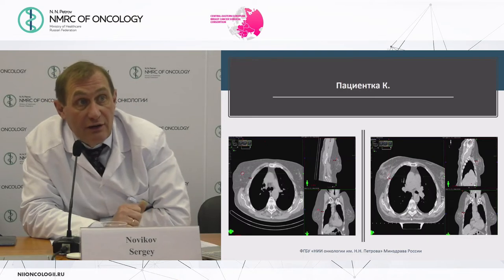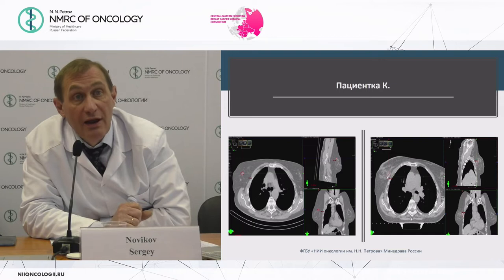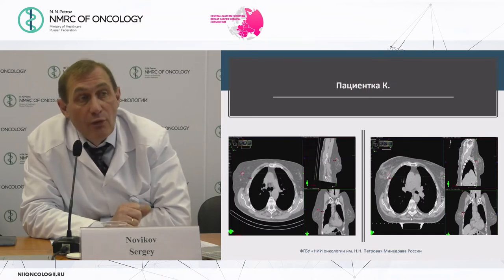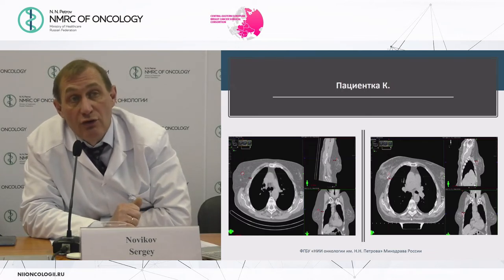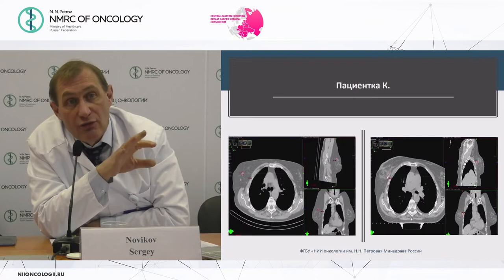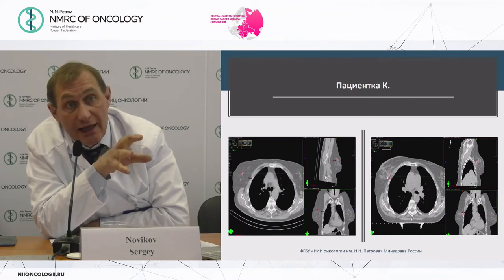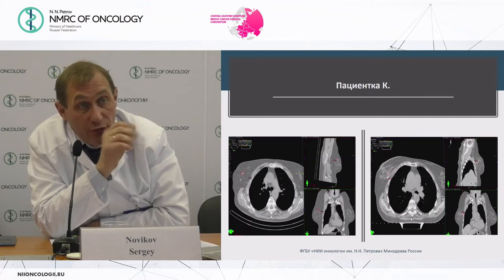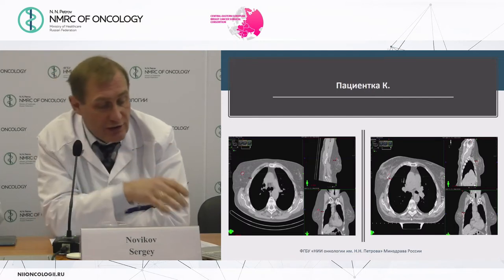And this is another case. You see on the left is the tumor. On the right are the clips. And here we see some discrepancies in the position. In this case, of course, we start to think. We are trying to include all clips in our everyday practice, and also the projected position of the tumor, which was before operation. In this case, of course, probably it would be possible. But the question for us is that all clips are located very deeply. I'd like to draw your attention to this fact, because it will also be related to our further questions.